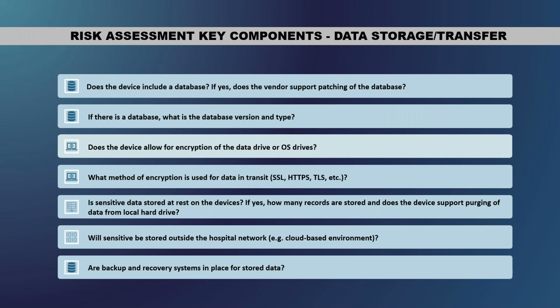Where is the data being stored? Is it data at rest or data in transit, and how are you protecting it? Is it an SSL connection? Are you encrypting the data if it's in transit? Is there encryption on the operating system drives? For sensitive data, is there a purging process in place? How are we purging the system? Because with a lot of systems, the data will be stored on the medical device forever. So that's something you have to think about.